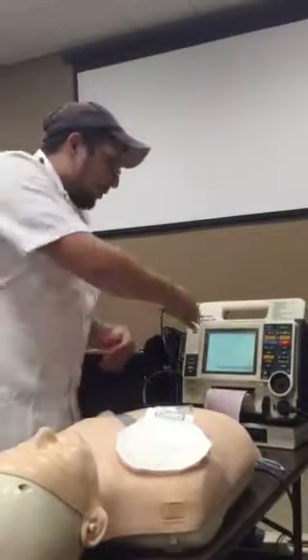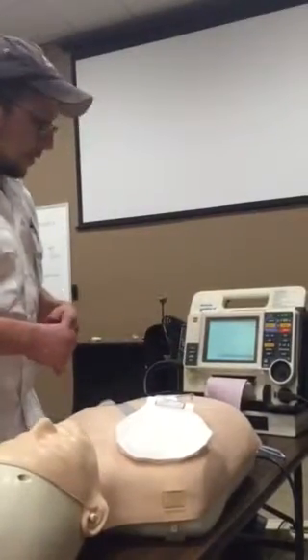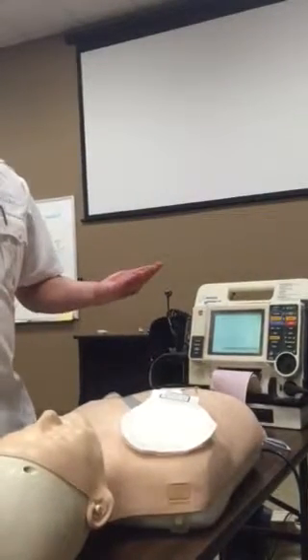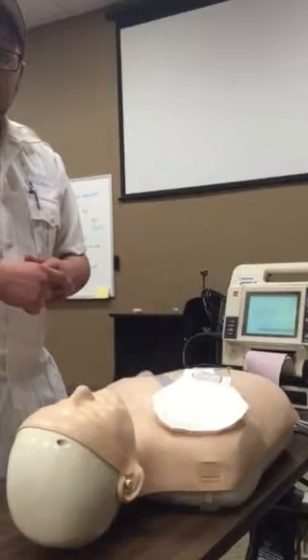Okay. Then I'm gonna reassess my rhythm. Is this the rhythm that I see on the monitor here? It looks like it. Okay. That looks like asystole on the monitor there. I'm gonna continue CPR on my patient. I'm gonna consider H's and T's. All right. I'm gonna give 1 milligram epinephrine every 3 to 5 minutes.